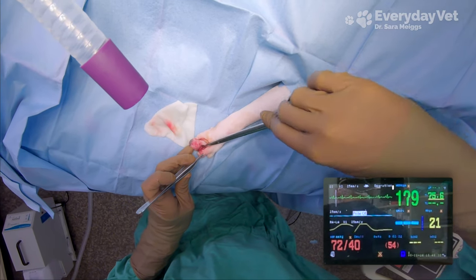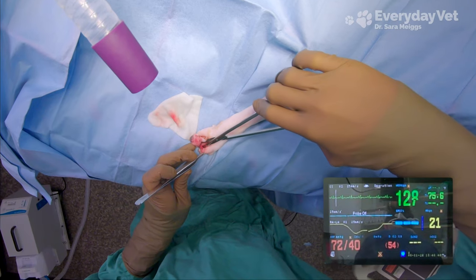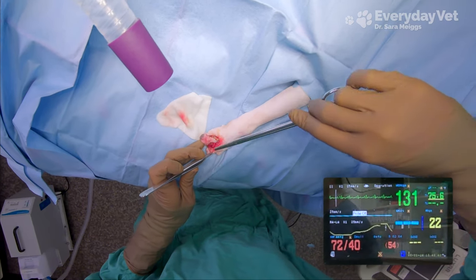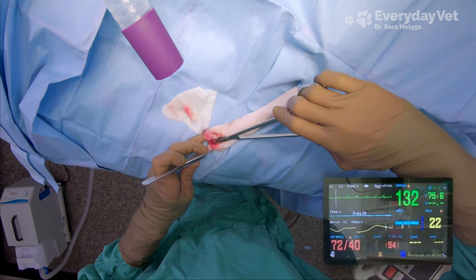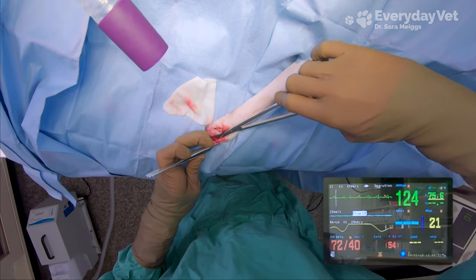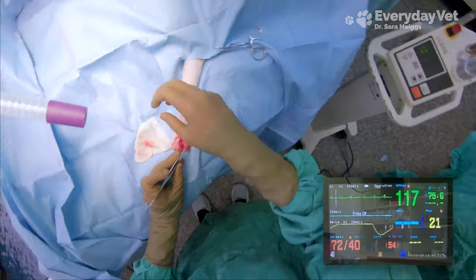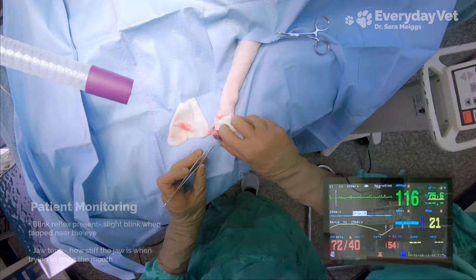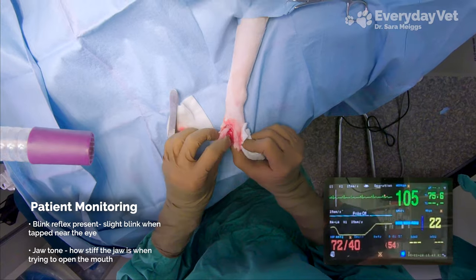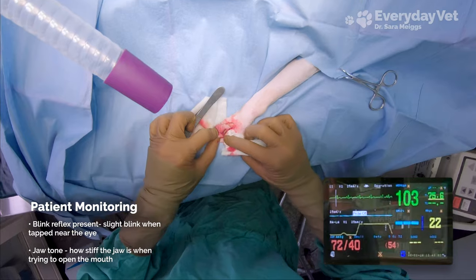The heart rate just increased. It's too soon to be from the fluid bolus, so it's most likely because of the lowered sevoflurane. With the lower inhalant gas, the cardiac system won't be as suppressed, and that's going to result in a heart rate increase. As the heart rate increases, so will the cardiac output, so I'm expecting that the blood pressure should start to improve as well. Now we'll just have to make sure that he doesn't start to wake up since the gas level is lower. The assistant is standing near his head to check for facial muscle tone and make sure that he isn't starting to blink, because those are the early warning signs that he might be starting to wake up.